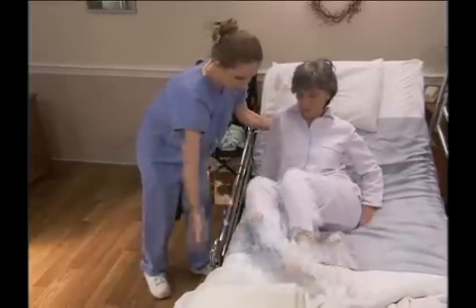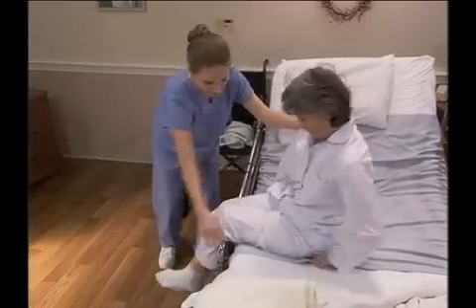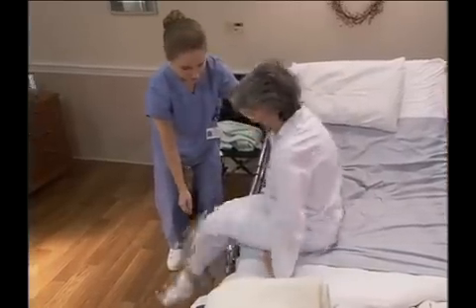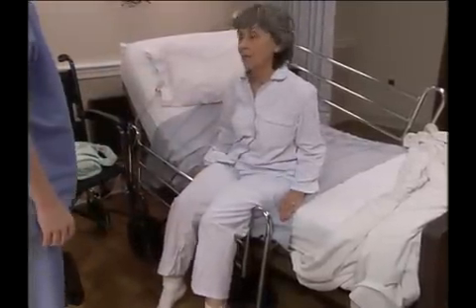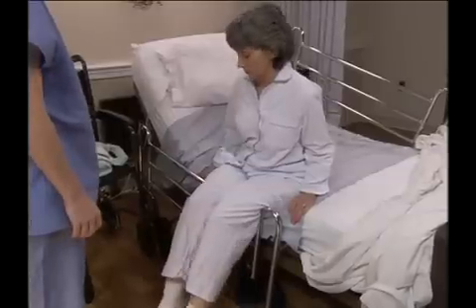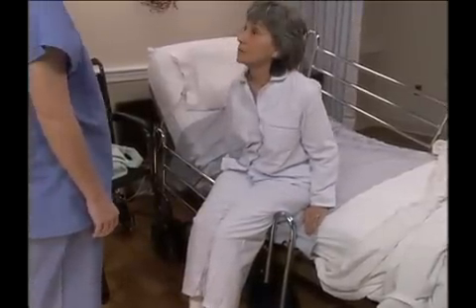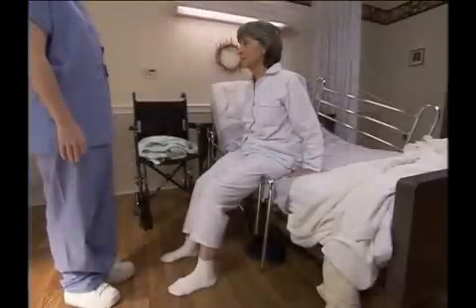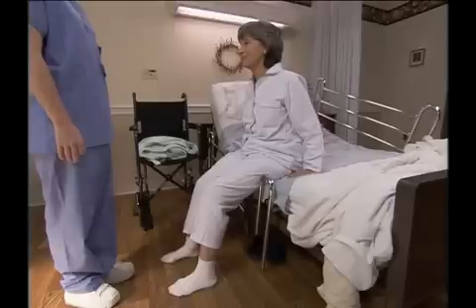Now ask the person to rise to a sitting position by using the elbow of her bottom arm to raise her upper body while pushing against the mattress with her other hand. Advise the person to allow her legs to swing over the edge of the bed while you help guide her into an upright position. Next, allow the person to dangle or rest in this position for a few minutes before helping her to stand up.